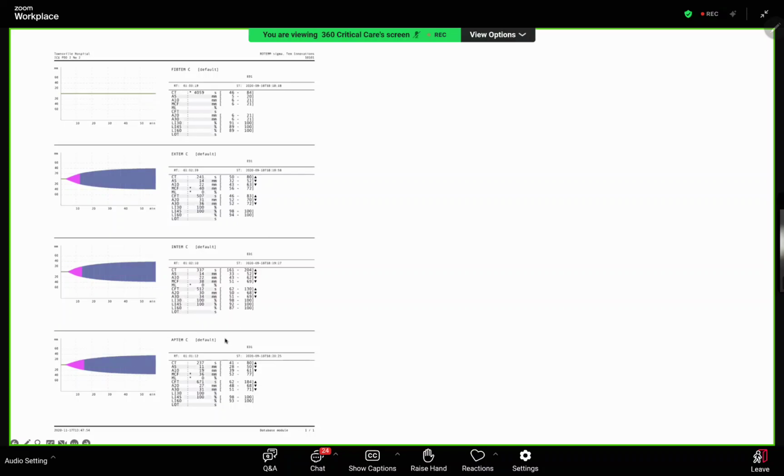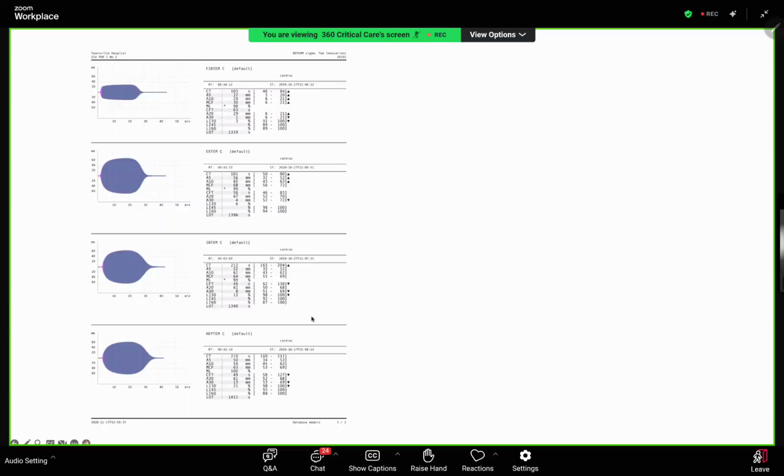Okay, got it? Early fibrinolysis, you can see that. So you again supplement fibrinogen in this case. What is this one?